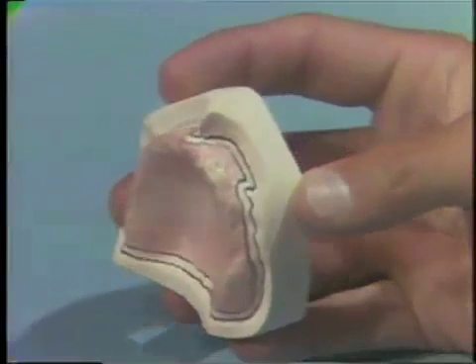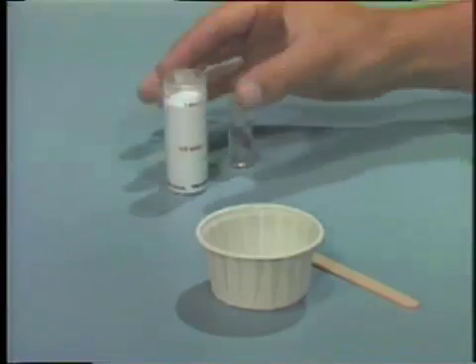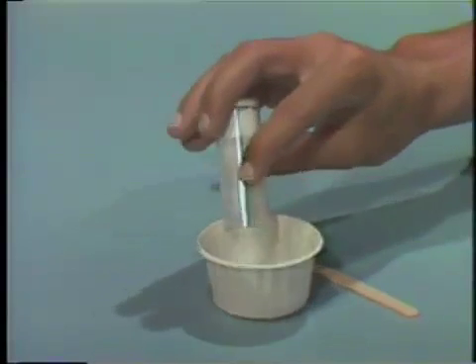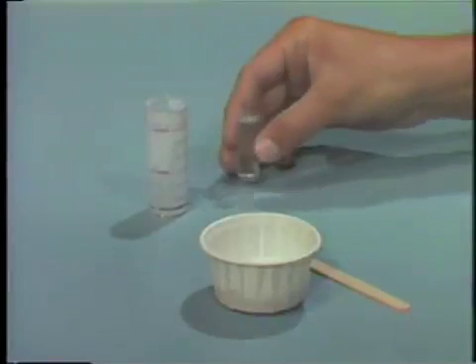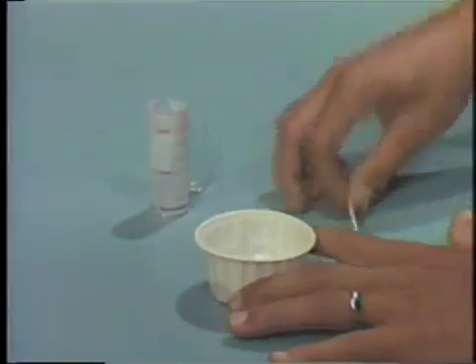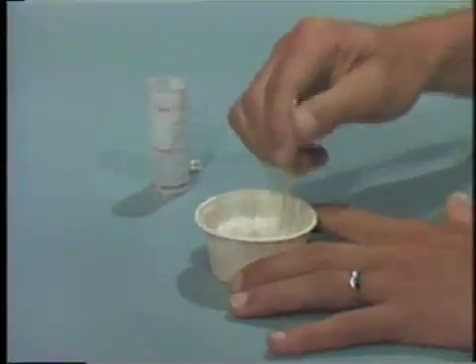Once the trimming is finished, prepare a mixture of auto-polymerizing acrylic resin following the manufacturer's instructions. Place the monomer in a paper cup and add the polymer. Stir the mixture to wet the powder particles and then allow it to set.